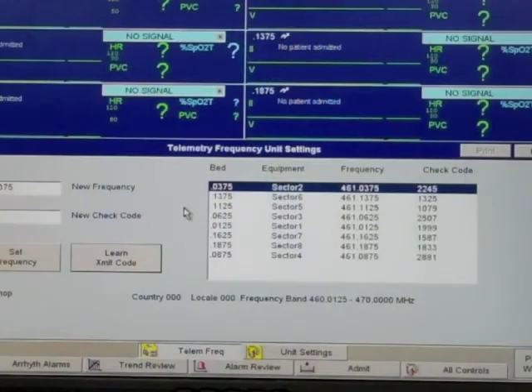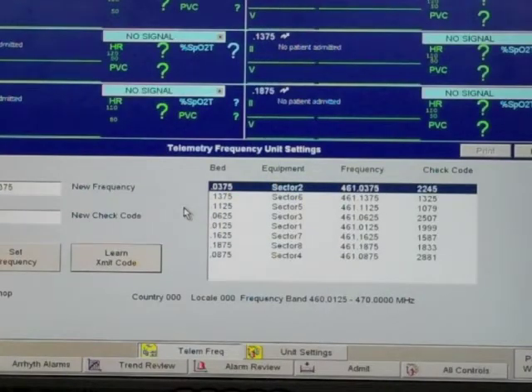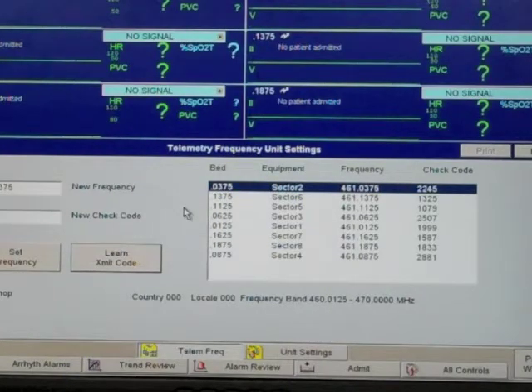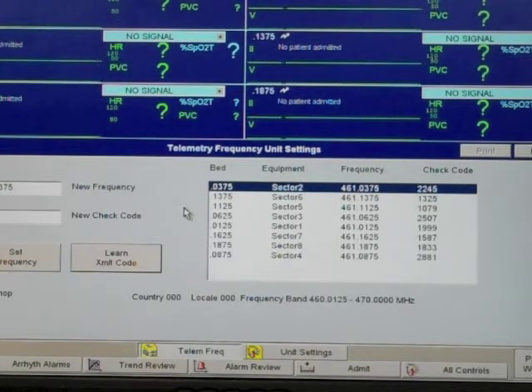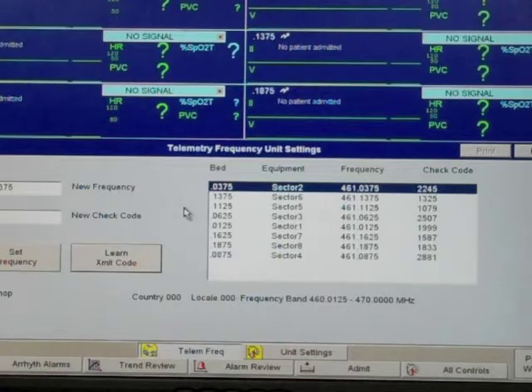Welcome to Biomed University. In this video, we're going to show you how to troubleshoot your Phillips telemetry system by verifying your PICS setup. This video illustrates how to verify your PICS telemetry settings without leaving monitoring mode. It is based on a standalone system running on version J software.